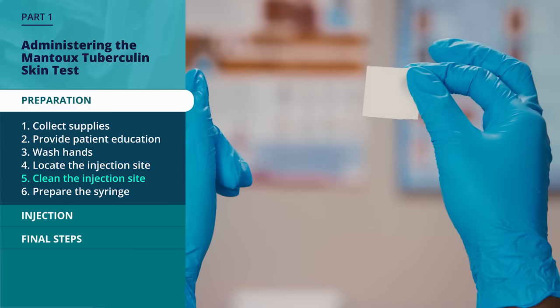To locate the skin test site, inspect the arm in good light and on a firm surface. Turn the arm palm up, support it, and slightly flex it at the elbow. Sometimes the site has erythema, a reddening of the skin that can also have swelling. The erythema should not be measured. Whatever induration is present at 48 to 72 hours should be measured and recorded. Only the part of the reaction that can be felt, which is the induration, is measured, even if there is soft swelling or redness at the site. Keep in mind there might not be an induration. Reactions to the tuberculin test at the injection site can range from no induration to a large, well-defined induration.